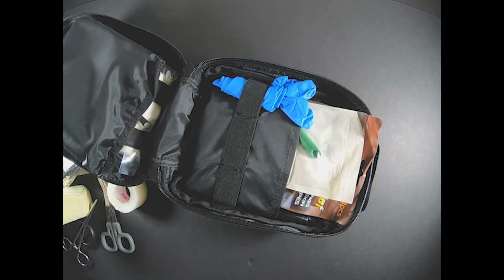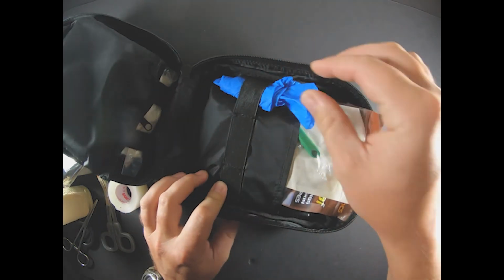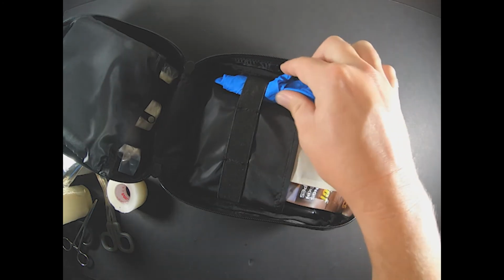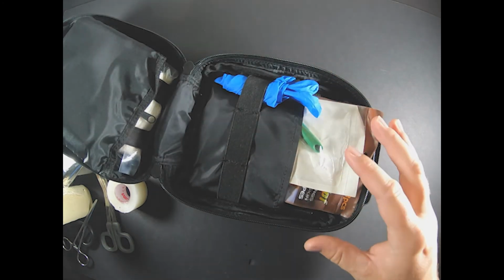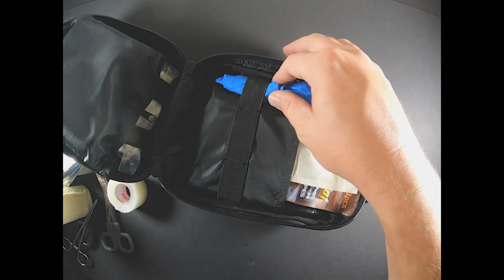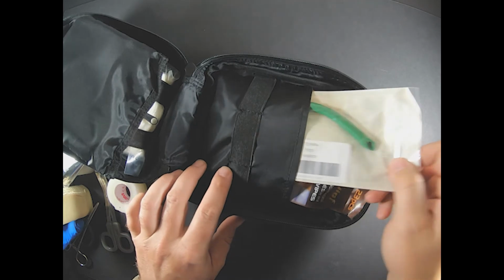All right. Again, we got the third section here. I do have a set of Nitrile Gloves. They are blue. These ones I don't believe. I'd have to check. I'm not sure if they're latex free. But I don't particularly care for the black ones when it comes to first aid, because you want to be able to see blood. If there's bleeding and you can't see it, black pretty much hides everything. And you're not going to be able to see everything. So these basically just tuck back in here. You don't have anything to worry about there.